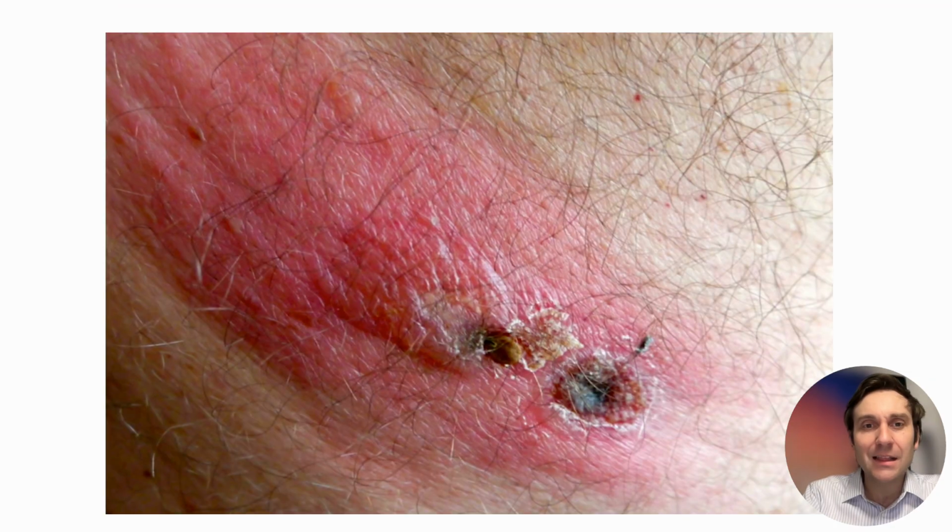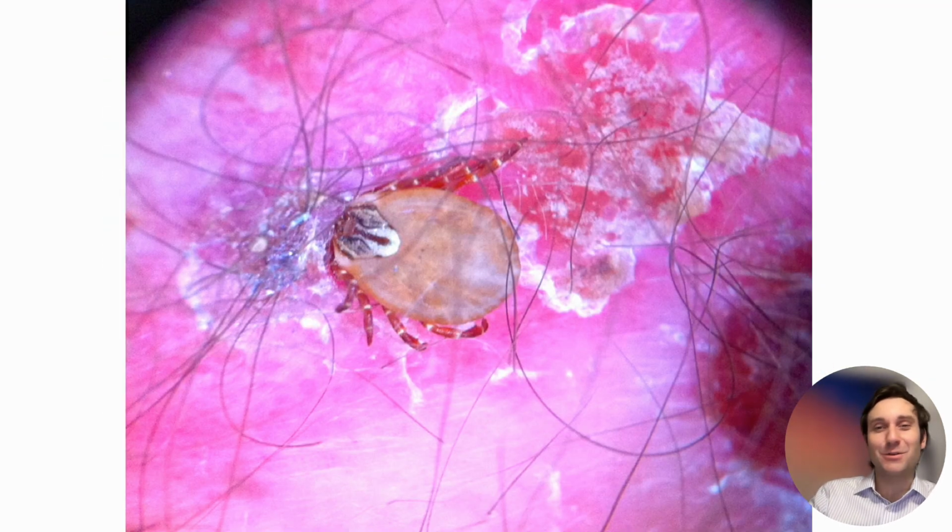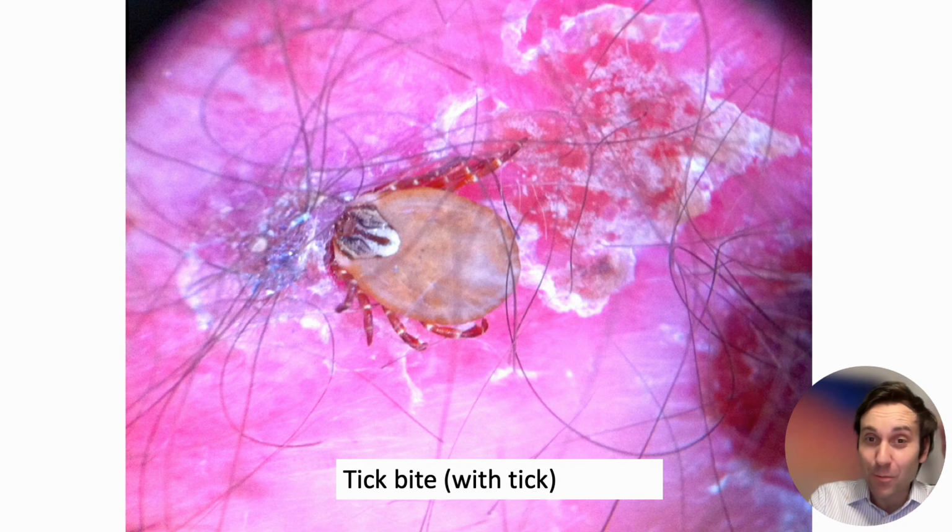But take a look at that. Dermoscopy 1, 2, 3. One second diagnosis. Boom. This was not zoster, right? This was just a real tick here, feeding on the blood of this poor patient. So this was a tick bite with tick.